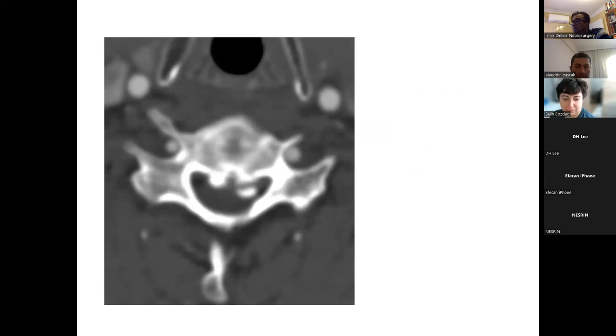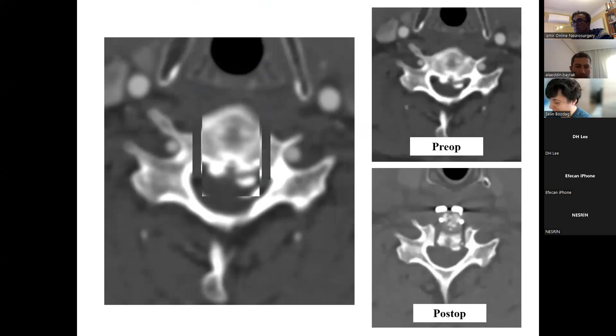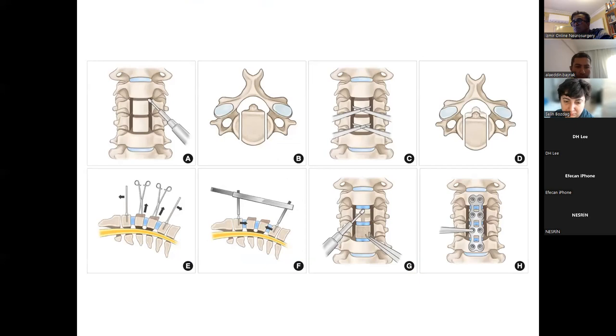This is the basic concept of sliding osteotomy. We expand the stenotic canal by anterior translation of the involved vertebral bodies as well as ossified masses. After multi-level discectomy, the vertebral bodies are longitudinally cut on both sides with a drill. The freely movable central fragments are anteriorly translated along with the ossified masses. Translated bodies are initially fixed with tight cage insertion. Then the anteriorly protruding part is shaped down and finally fixed to a metal plate with screws.